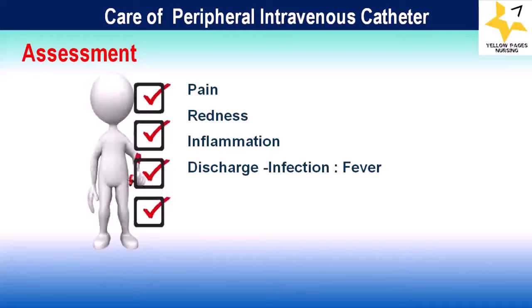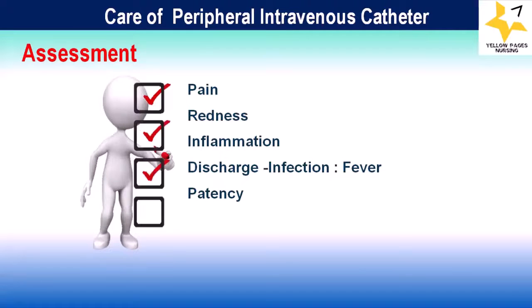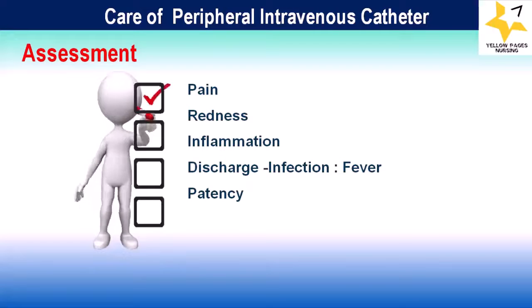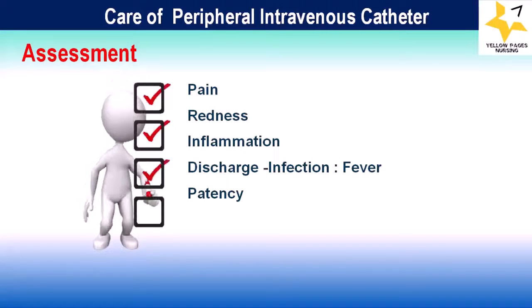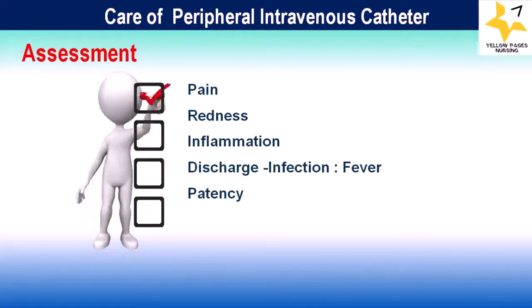Next comes patency. Patency refers to the unobstructed flow of fluids through the IV cannula, and it is crucial to check once in a shift in order to ensure that it remains open and functional for the safe and effective administration of medications, fluids, or other treatments.